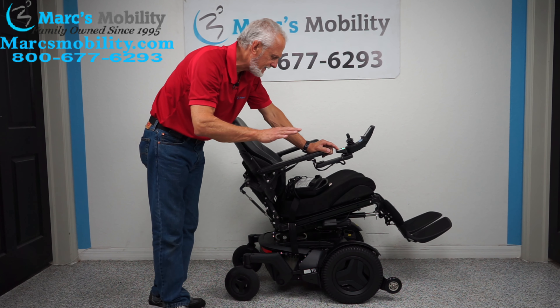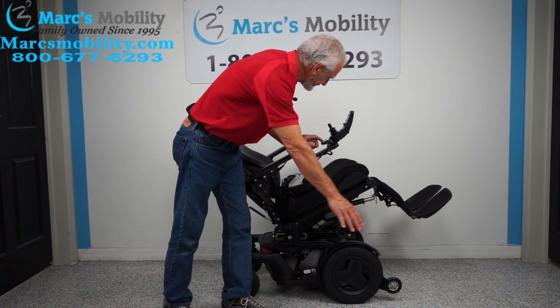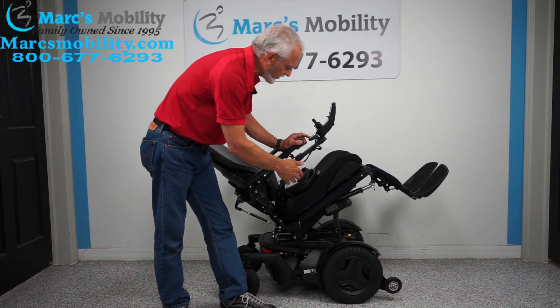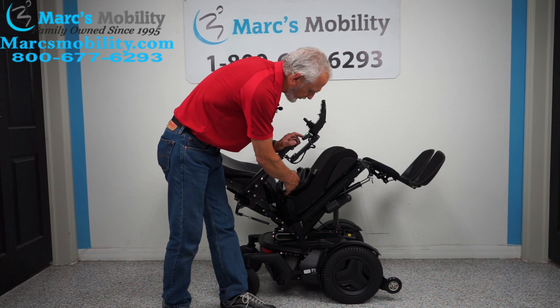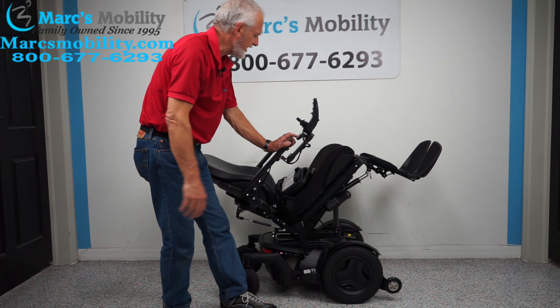You're going to be at 22 inches when you're all the way down, and now we're tilting back. This is good if you want to take pressure off your bottom, pressure off your back. You just want to relax or get some circulation in your legs.